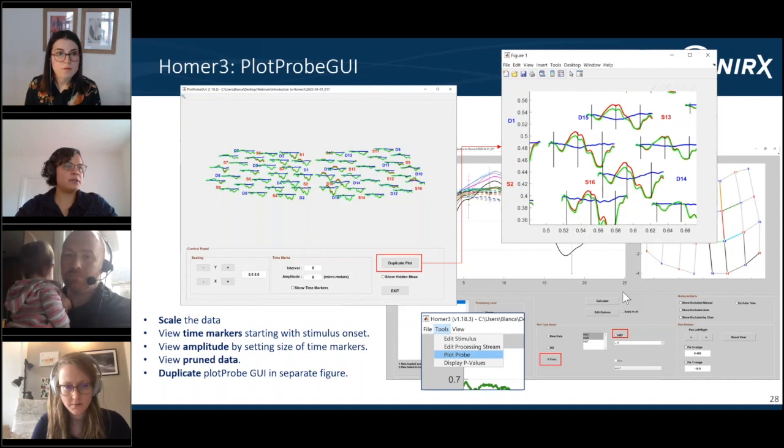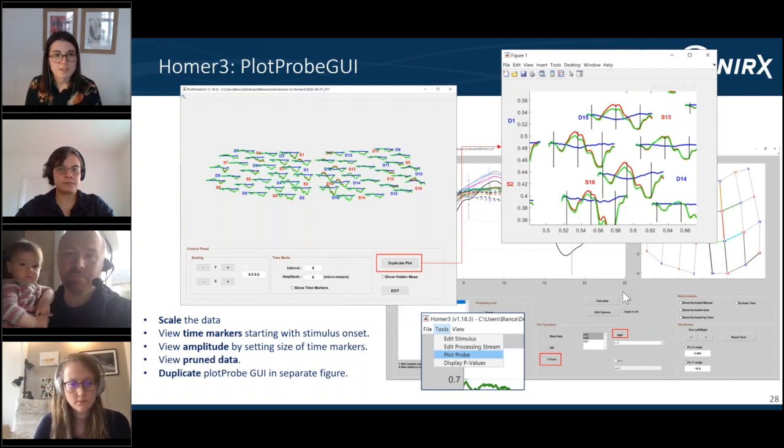We also have another question here for Blanca. Is there hyperscanning functionality within Homer3? Do you know that? That I'm not sure. If not, we can cover that for next week's webinar.